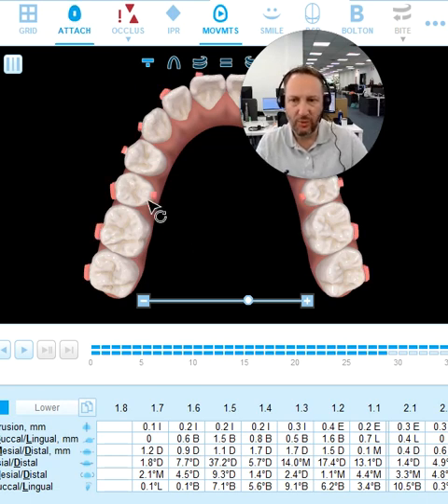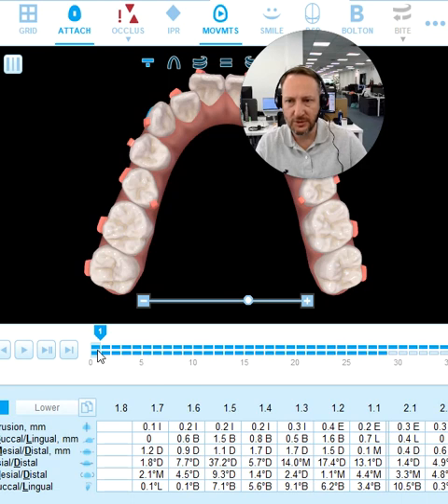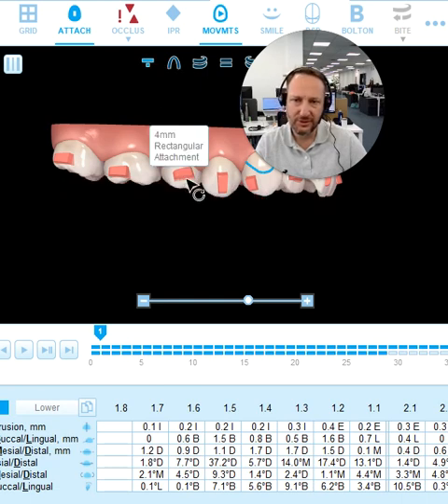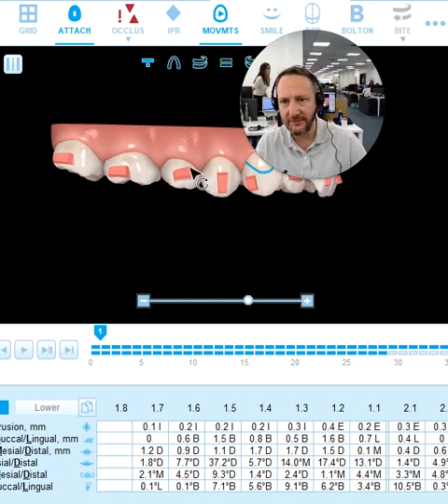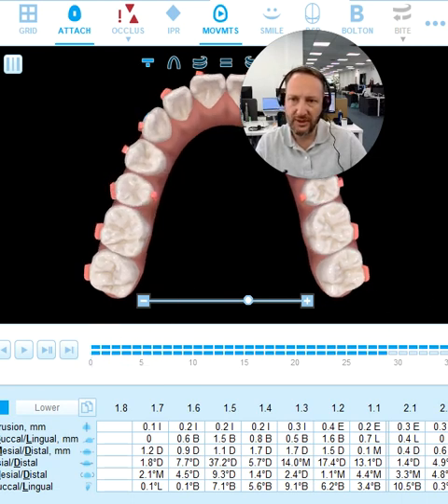In this case, how did we do this? Placing one attachment on the buccal surface and another attachment on the lingual surface. I decided to use a rectangular horizontal attachment here, and since we are rotating the crown distally, the flat surface was to the mesial. On the palatal side, we use a vertical one, so we can have a bigger distance from this area on the distal to the attachment, so we can promote this movement with more predictability.